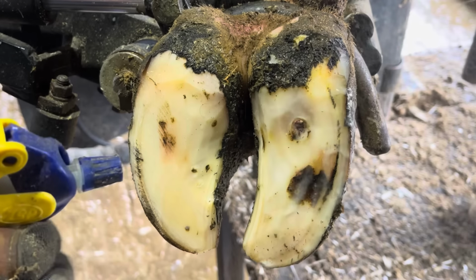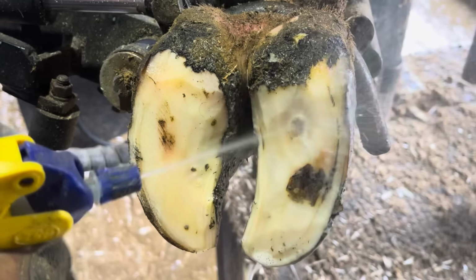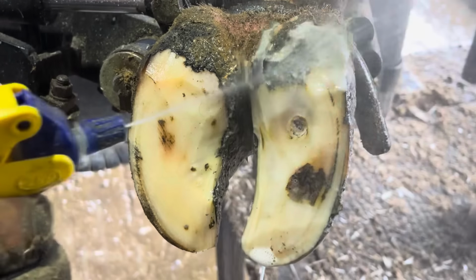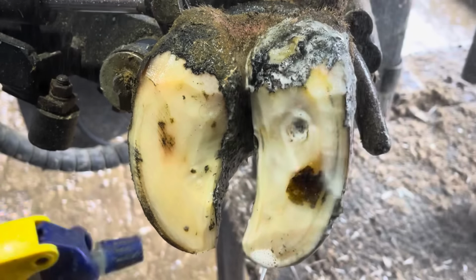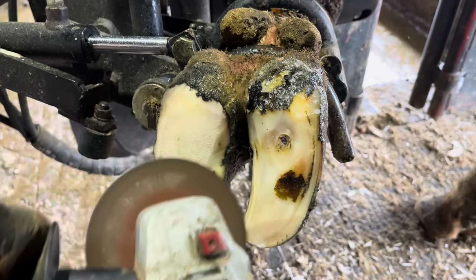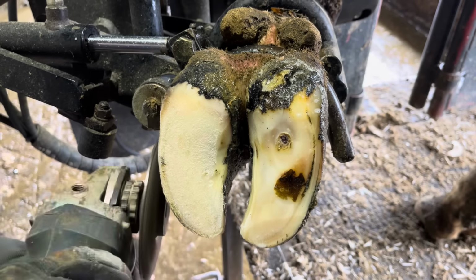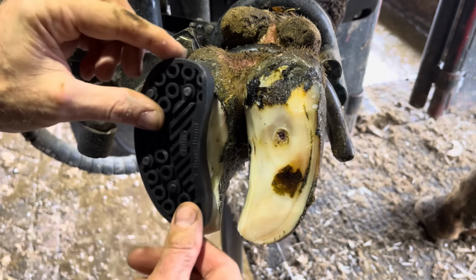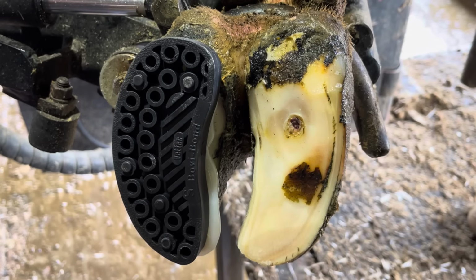Once again, that darker mark below the lesion is just some staining. I don't need to remove any more hoof horn there, otherwise I'll make that sole thinner than I want it. So I just leave it be. It doesn't hurt anything. It's just a different color. That's simply it. We get a block on this other claw, and then we'll treat that once again with some salicylic acid to get that dermatitis to go away.